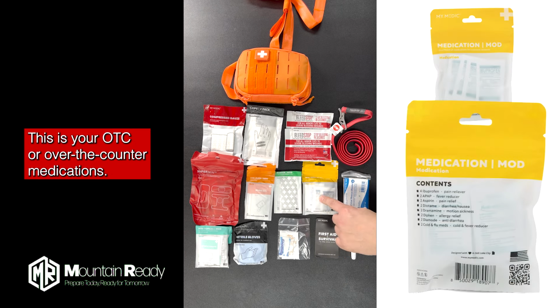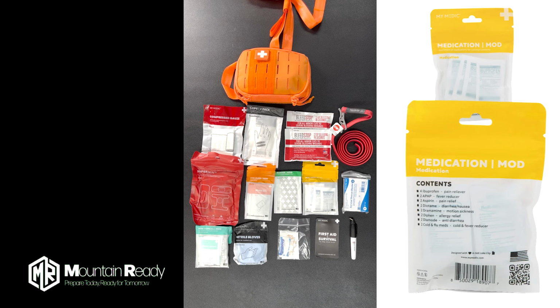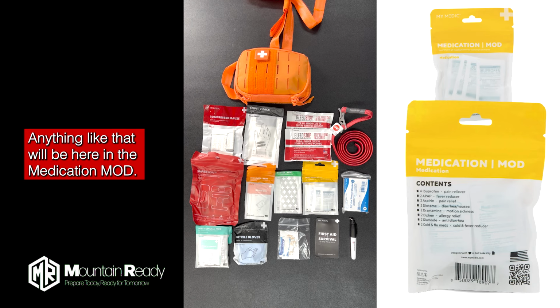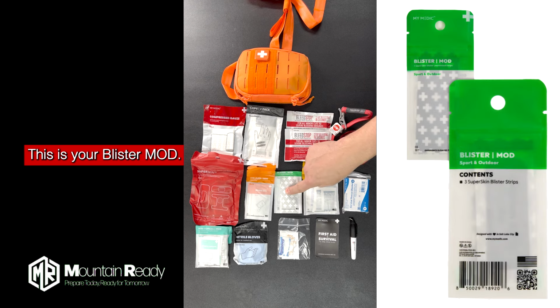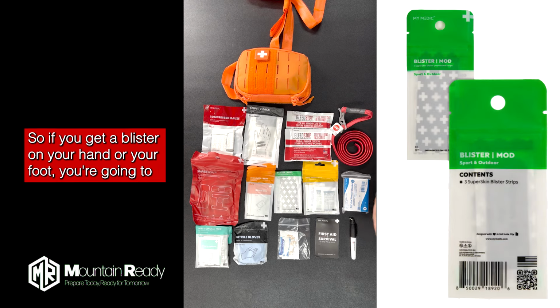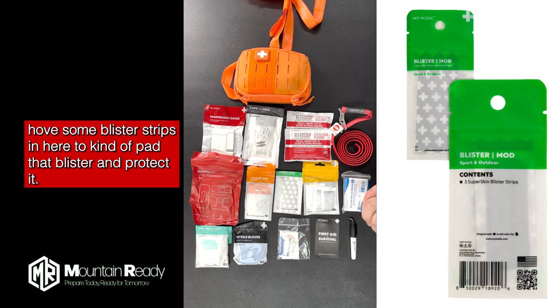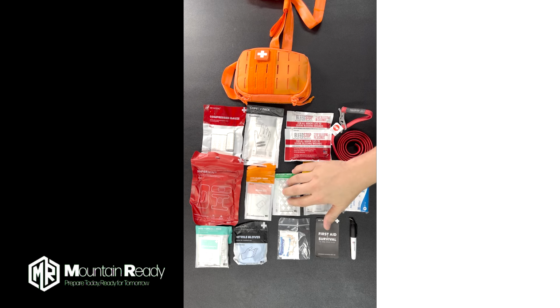This is your OTC, your over-the-counter medication. So think of anything like pain relief, fever reducer, nausea, diarrhea, upset stomach, allergic reactions. Anything like that will be here in the medication mod, okay? This is your blister mod, right? So if you get a blister on your hand or your foot, you're going to have some blister strips in here to pad that blister and protect it and ensure that it doesn't rip off. Those are your blister mods, okay?